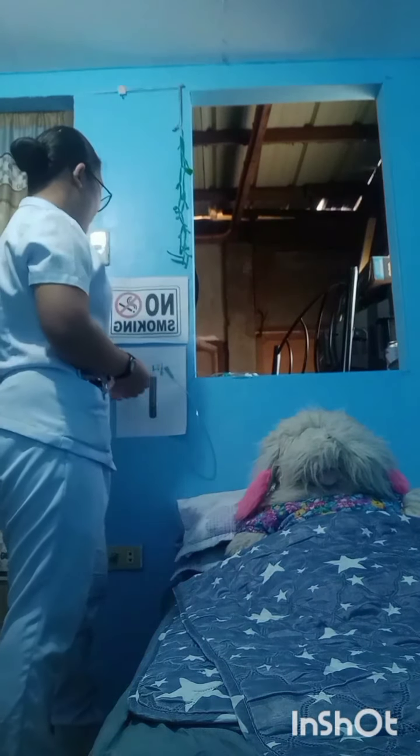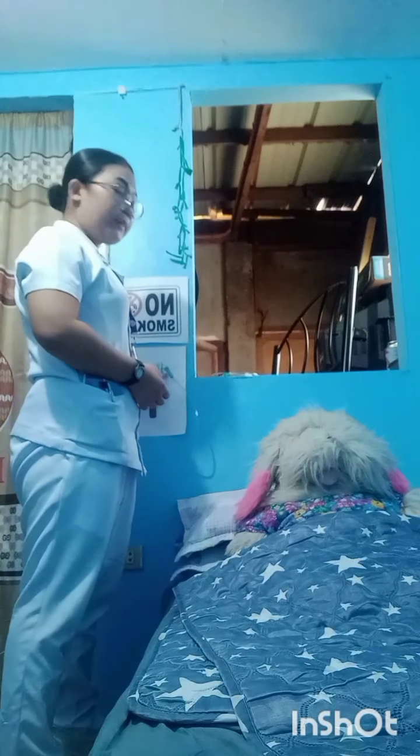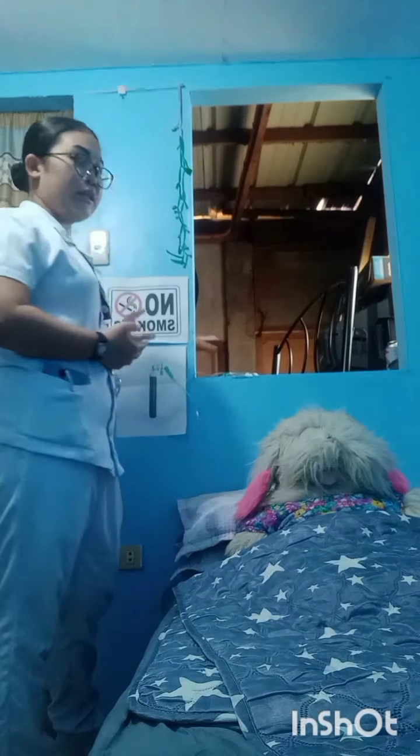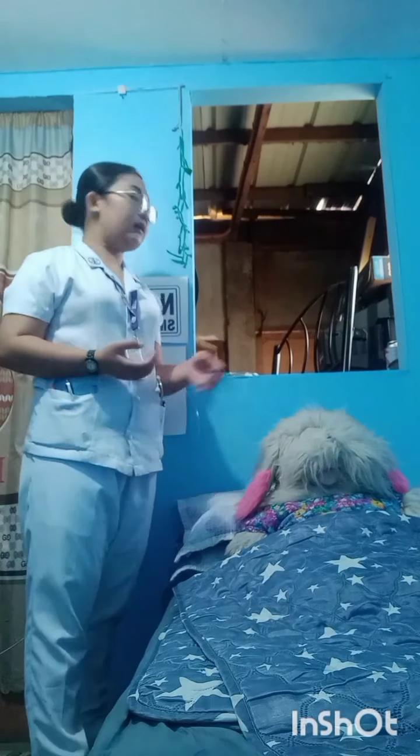Next is we're going to turn on our oxygen at the prescribed rate and ensure the proper functioning of it. This one, we're going to turn it on. And we're going to ensure its proper functioning because there are instances na hindi gumagana yung ating oxygen tank or oxygen wall outlet.